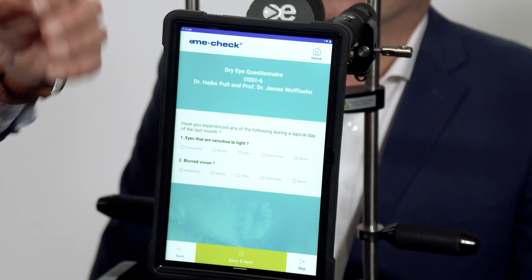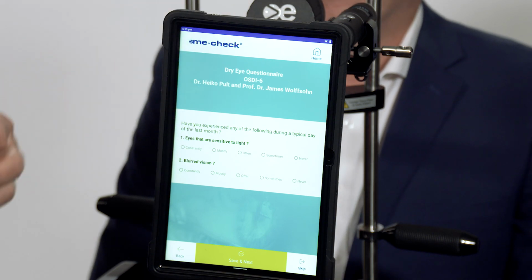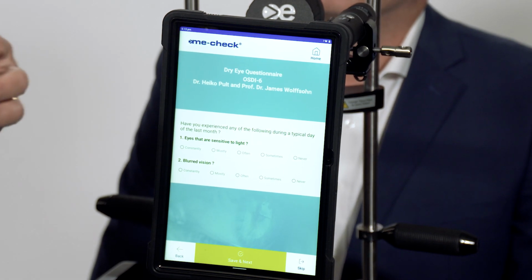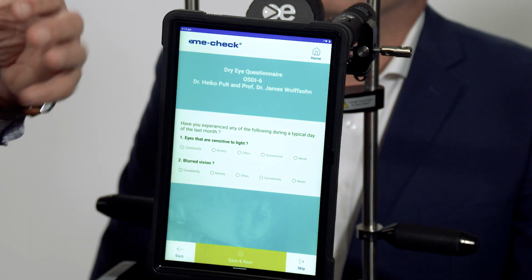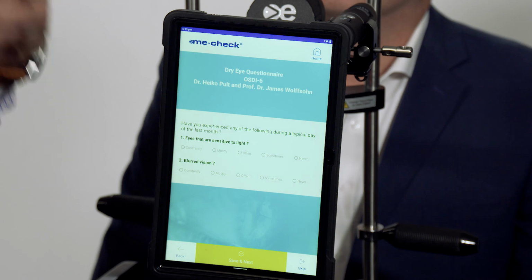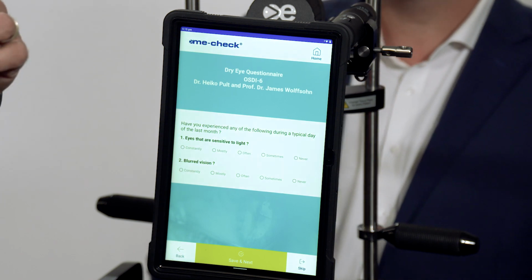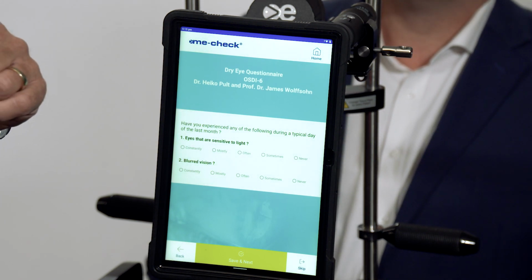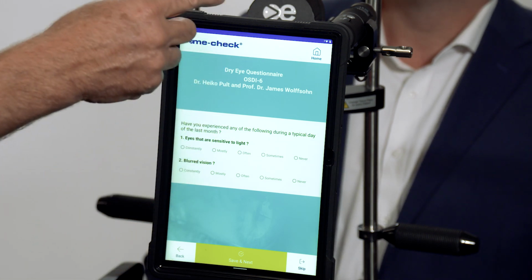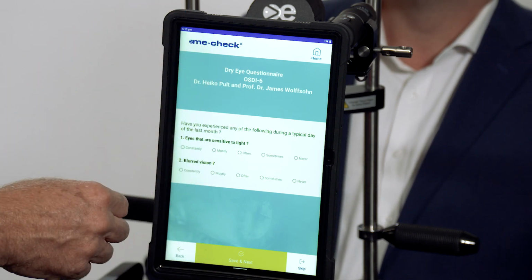This is something that the doctor could have either done with the patient before they got to the instrument, but if they did not collect what we call an OSDI score, an ocular surface disease index score, this is the subjective state of the patient in relation to their complaint about dry eye. We're looking to see at what level does the itchy, scratchy, dry, visual dysfunction, problems with night vision compromise their daily routines. And a 6-question OSDI score is incorporated into the unit, and their questions will be as follows.